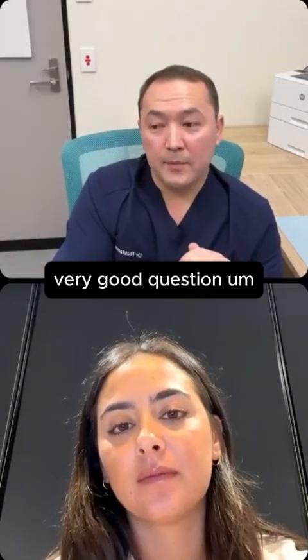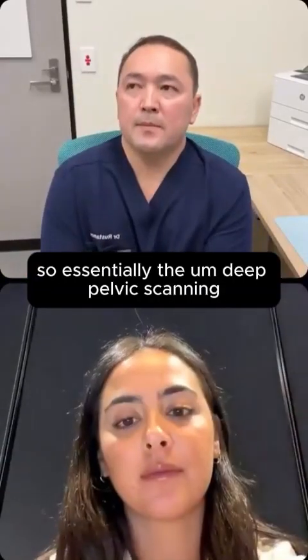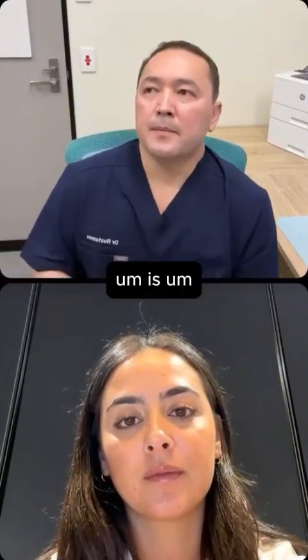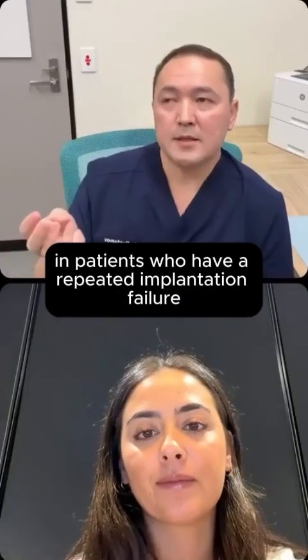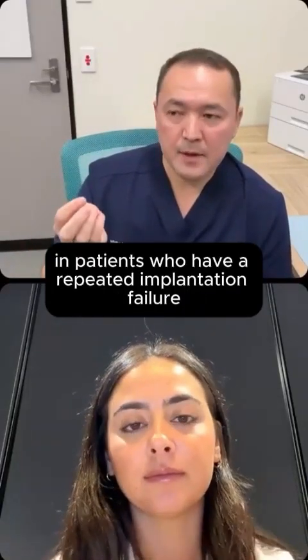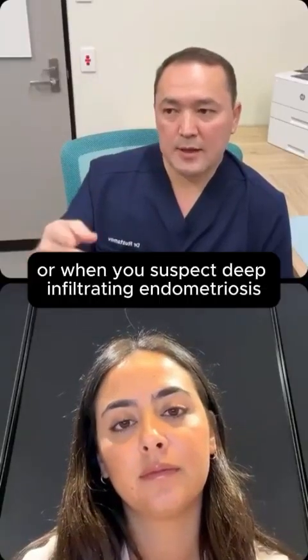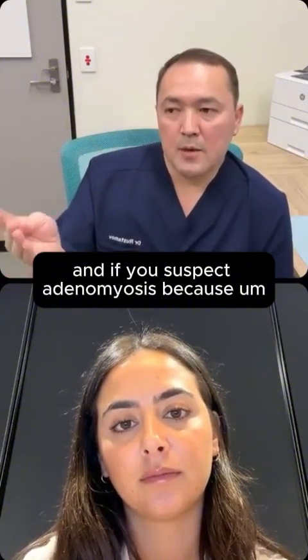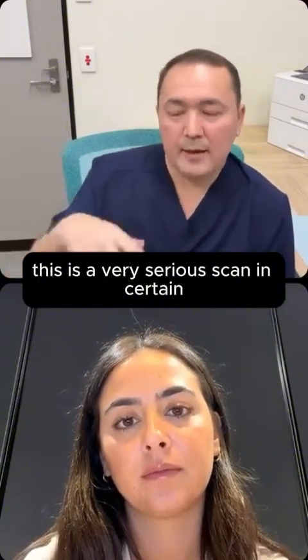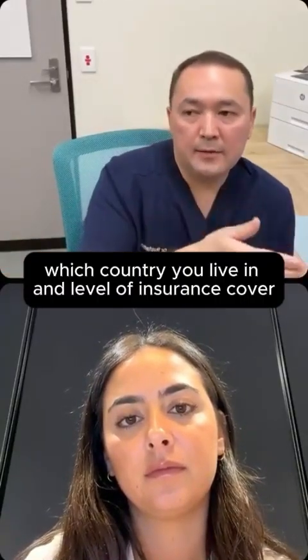Very good question. Generally, no. We request deep pelvic scanning in patients who have repeated implantation failure, who had 2 or 3 failed embryo transfers, or when we suspect deep infiltrating endometriosis, like stage 3, stage 4 endometriosis, and if we suspect adenomyosis.